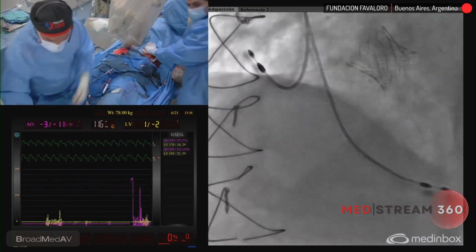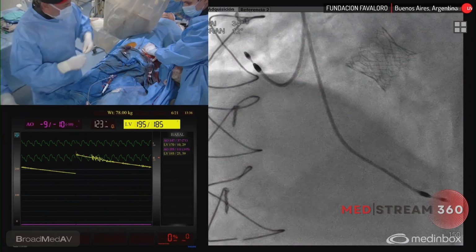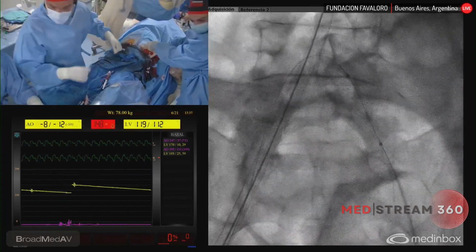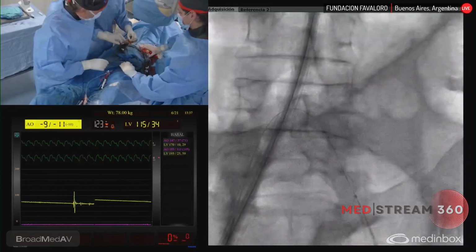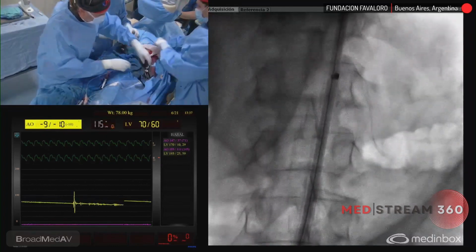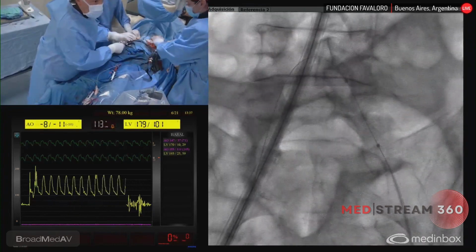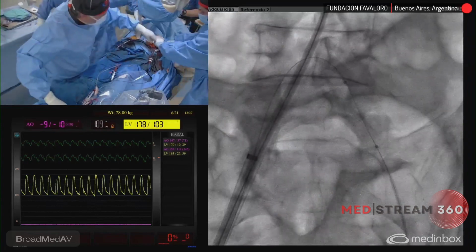So give me a balloon, an 8 mm balloon, access site before, and then we are going to close with an Angio-Seal. Give me the introducer, Carlos. Cut. Sí, cortalo. Okay, the blood pressure is okay. Carlos is going to hold the groin while I cross over with the balloon.